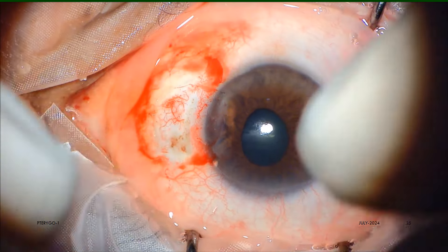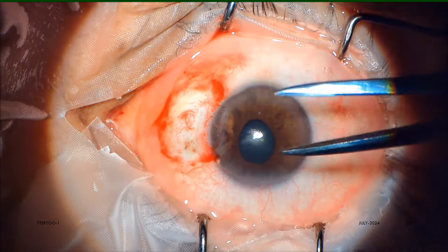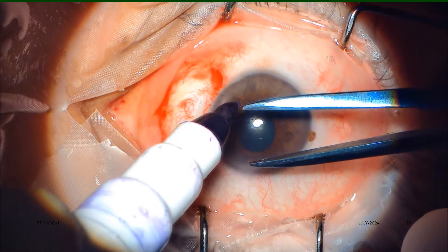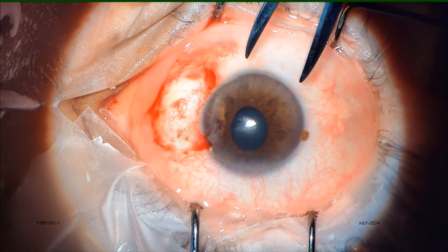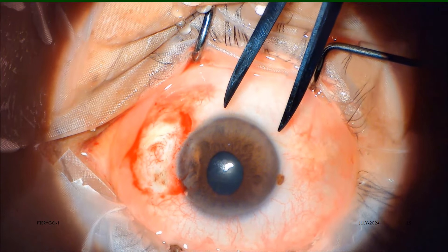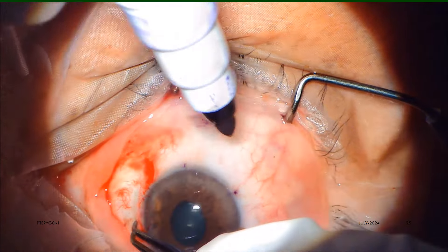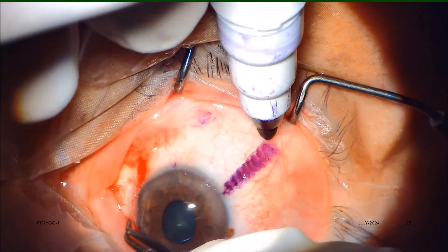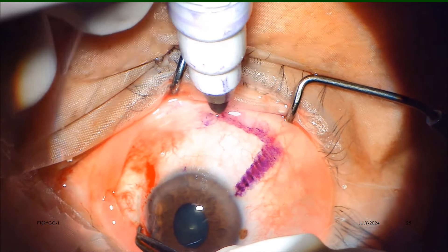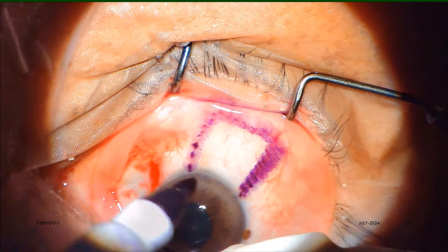Now the proposed limbus-based conjunctival autograft flap is sized and marked by Castroviejo caliper and sterile gentian violet medical marker pen. Our personal preference is to take the flap always from the lower fornix as far as possible, to keep the upper fornix virgin for a possible future need for anti-glaucoma surgery.